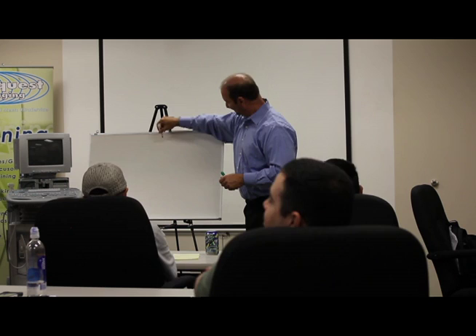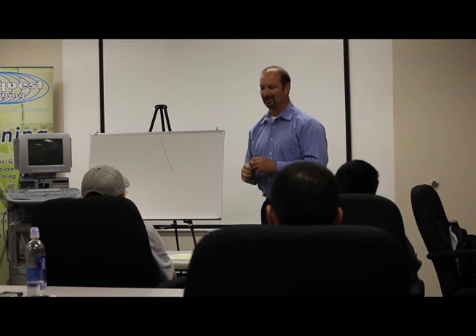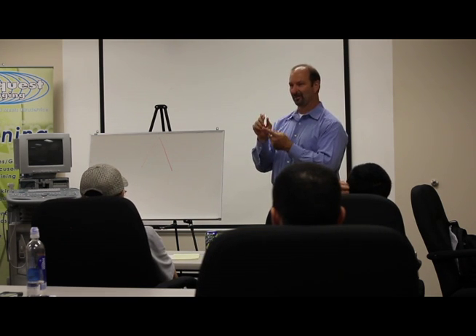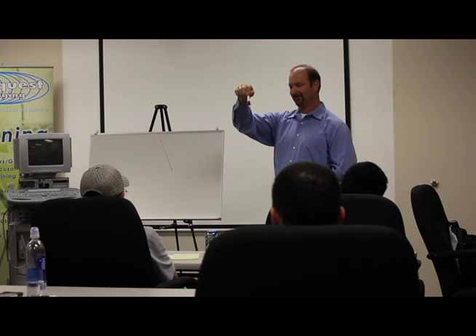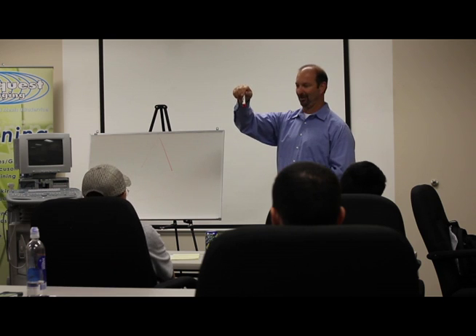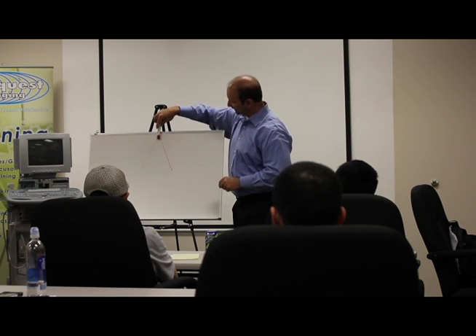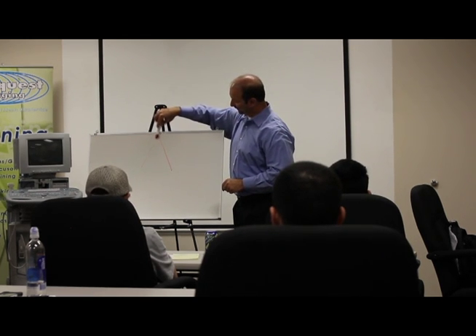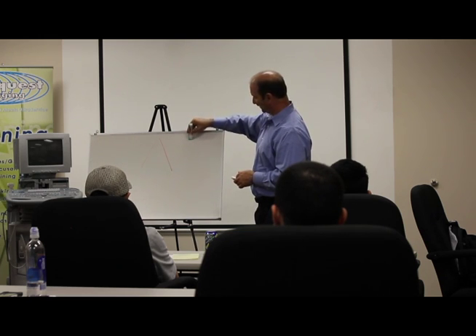But a sector image is from the day, and this will look familiar, where the image looked like this. When transducers originally became real-time, there was one crystal in the head of the transducer, and it just went back and forth like this. A wobbler had fluid all around there, and if you're talking to somebody and they mention a wobbler, they've been around a long time, and that's how it would make its image. And that gave you a sector-looking image because you just had this one transducer going back and forth like this. With phased array transducers, the face of that 4V1 transducer is going to be like this, 96 crystals.